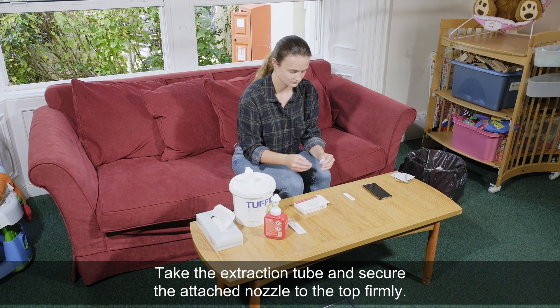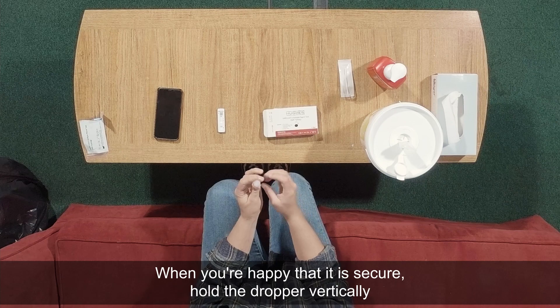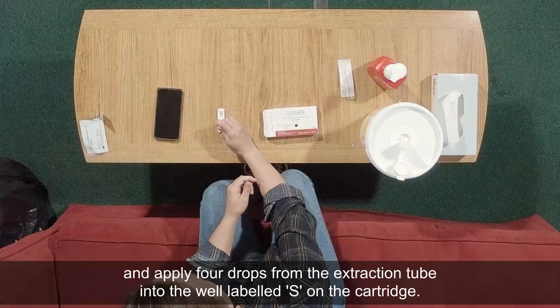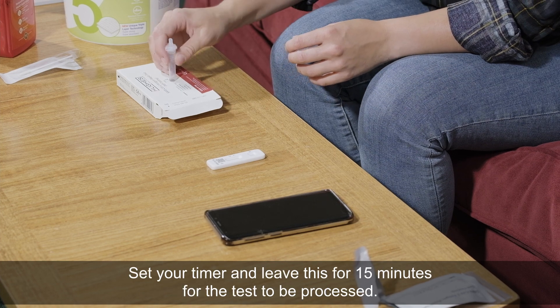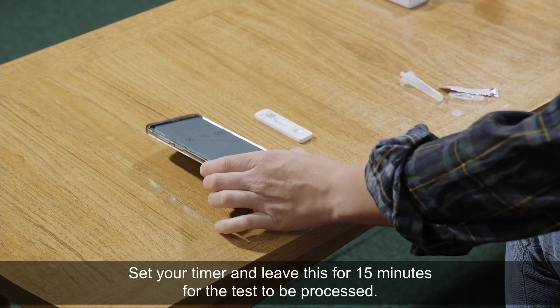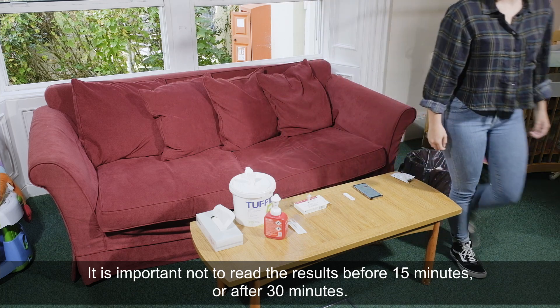Take the extraction tube and secure the attached nozzle to the top firmly. When you're happy that it is secure, hold the dropper vertically and apply four drops from the extraction tube into the well labelled S on the cartridge. Set your timer and leave this for 15 minutes for the test to be processed.